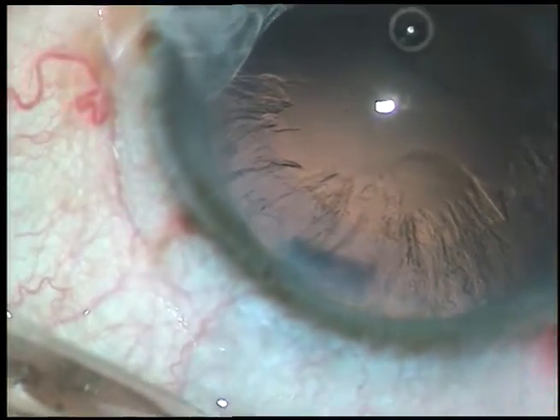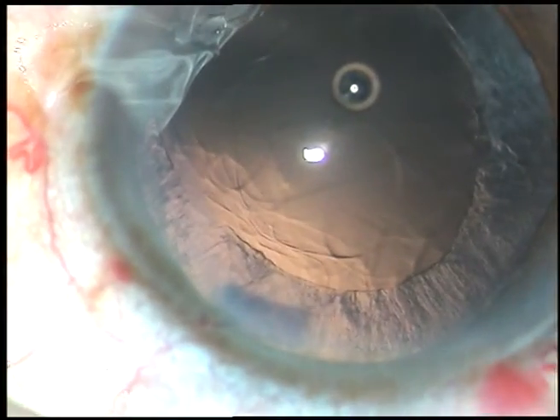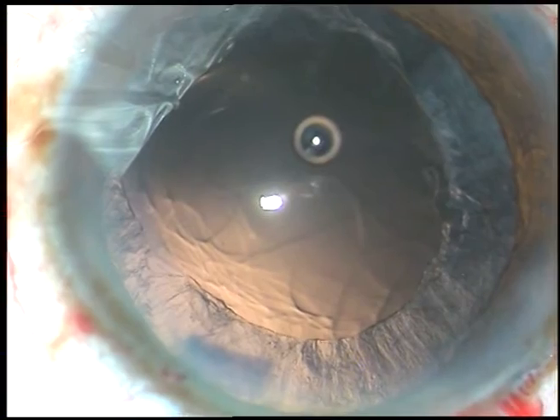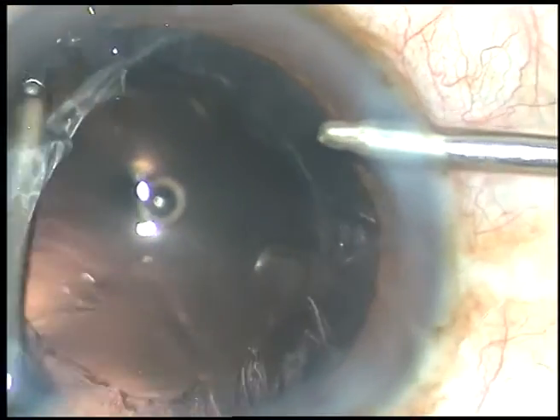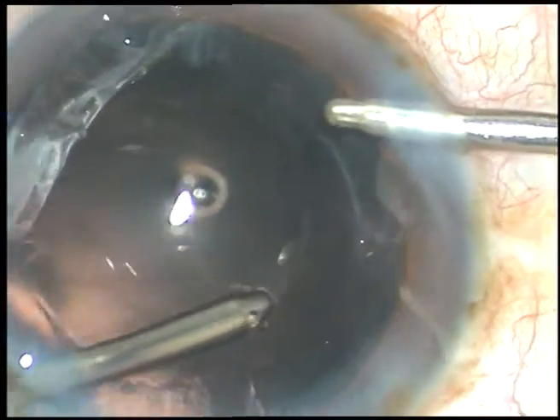Now, viscoelastic substance is injected. Cortical clean-up is done. In this case, cortical clean-up has been done using bi-manual irrigation aspiration. It is very easy to remove the cortical matter using bi-manual irrigation aspiration — you can have a 360-degree approach.